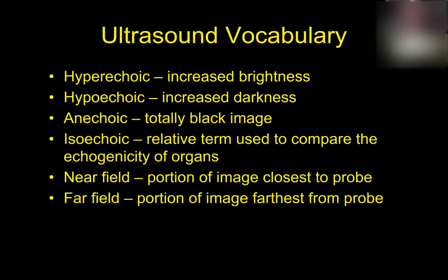Something that is anechoic means without echoes. So that's something that's totally black or pure black on ultrasound. An example of that would be, in a normal dog, looking at the fluid-filled urinary bladder. The urine inside there, ultrasound-wise, shows up totally anechoic or black. Okay.